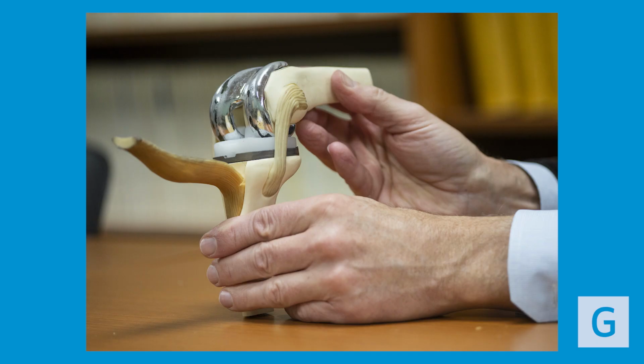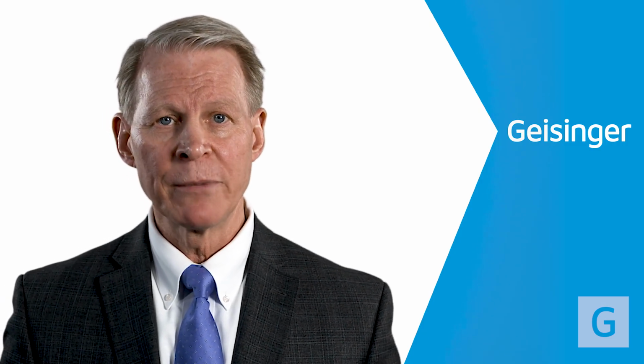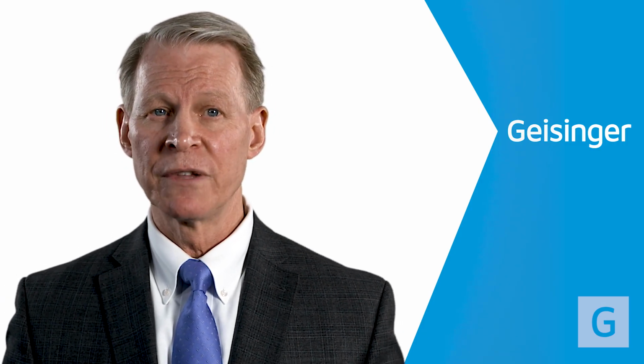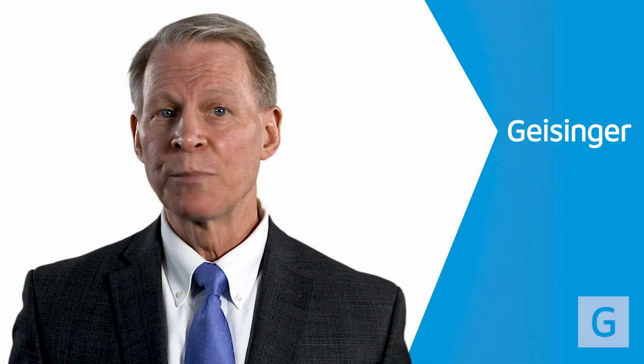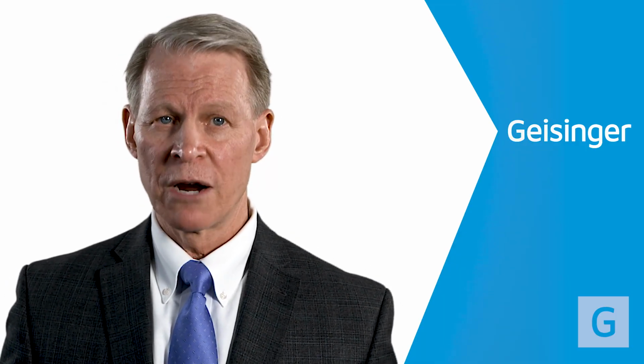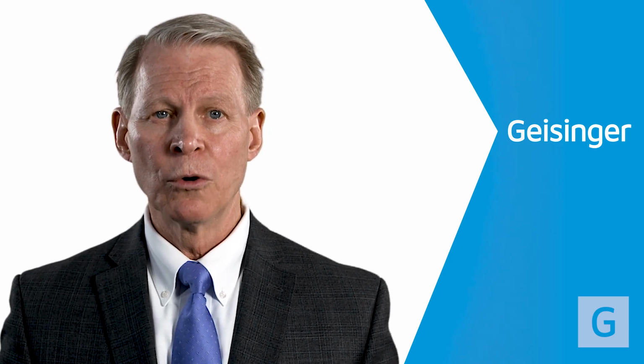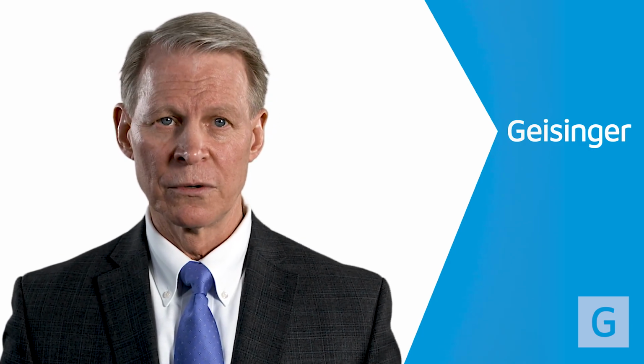During the procedure, metal and plastic components are used to resurface the ends of the bone that form the new joint, along with the plastic button to resurface the backside of the kneecap. These artificial implants help to improve the alignment, motion, and function of the knee. Upon completion of your operation, you will be moved to the recovery room. There you will be seen by members of our care team who will make sure that you're stable and comfortable.